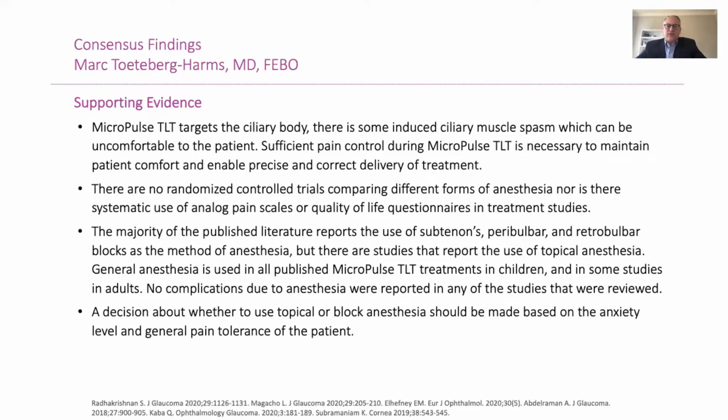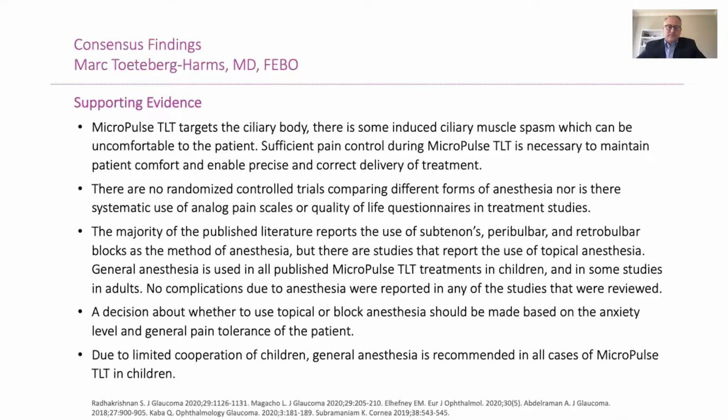A decision about whether to use a topical or a block anesthesia should be made based on the anxiety level and general pain tolerance of the patient. For children, coming back to that topic, due to the limited cooperation of children, general anesthesia is the recommended form of anesthesia in all cases when performing MicroPulse TLT. Yeah, that's from my side.